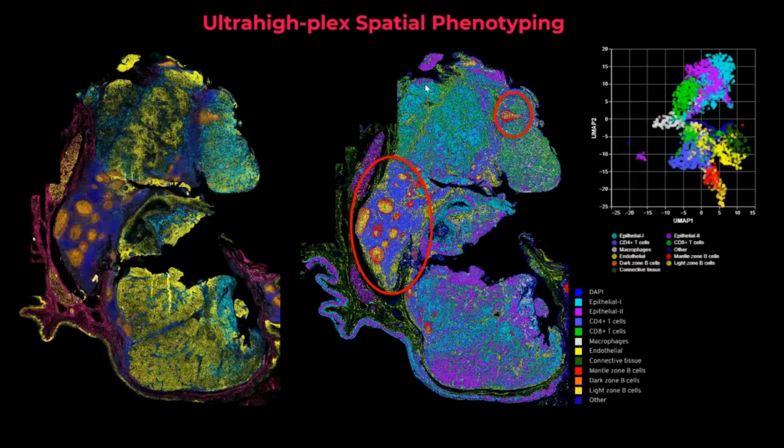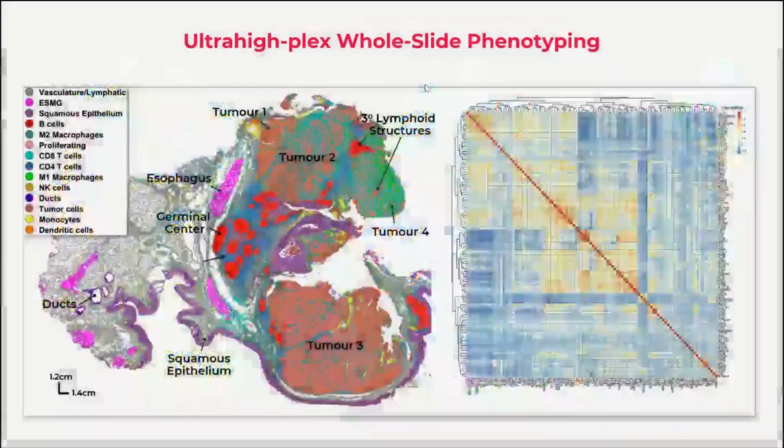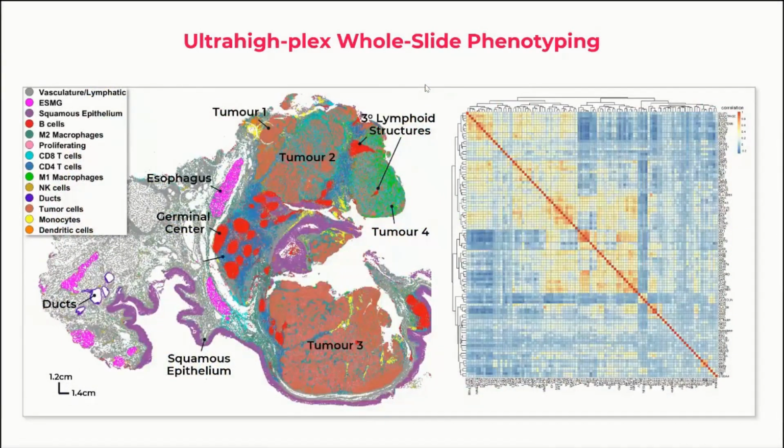But what you have at the top right is a tertiary lymphoid structure specifically infiltrating that bit of the tumor at the top right. Those tertiary lymphoid structures are absent in the area adjacent to it on the left, and you've almost got immature TLSs or really small unstructured TLSs at the bottom of the tumor. And so we can break this tissue down into subtumors. So taking this one head and neck tumor and breaking it down into subtypes.